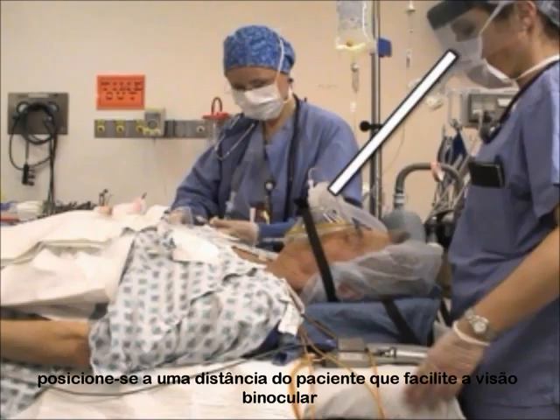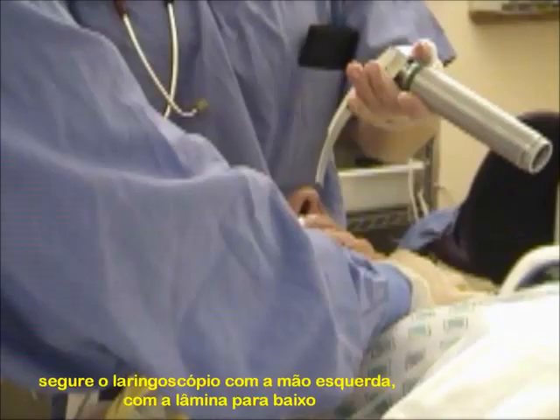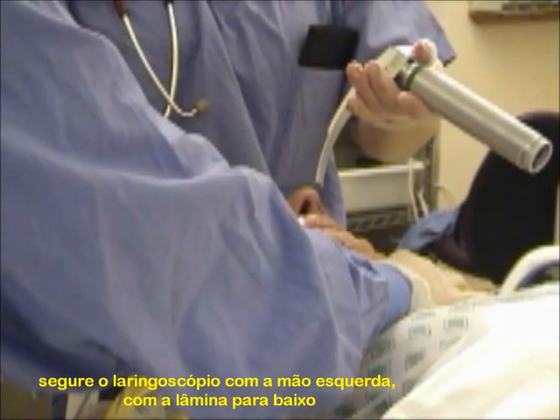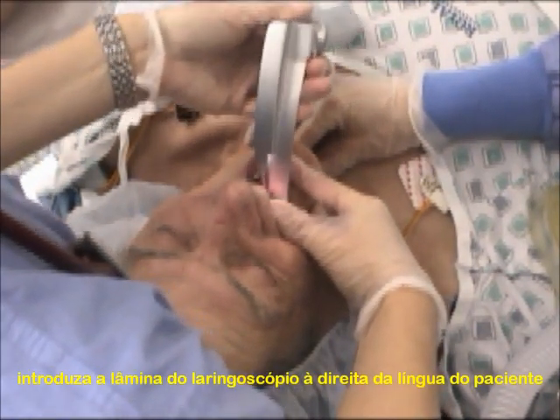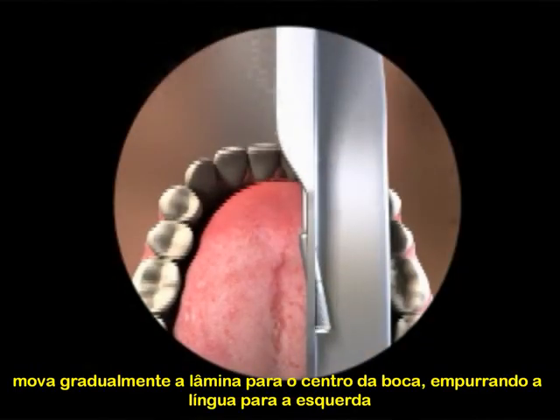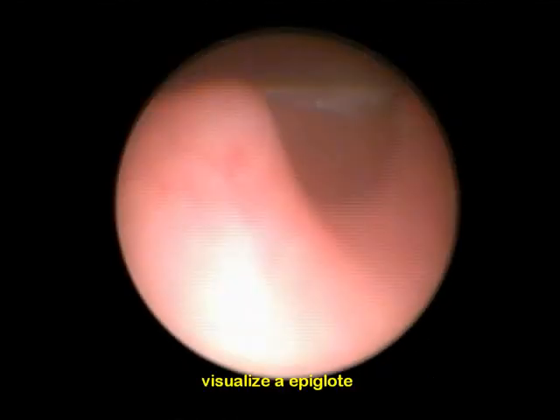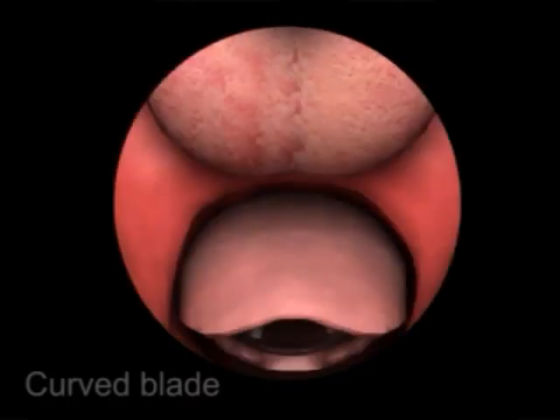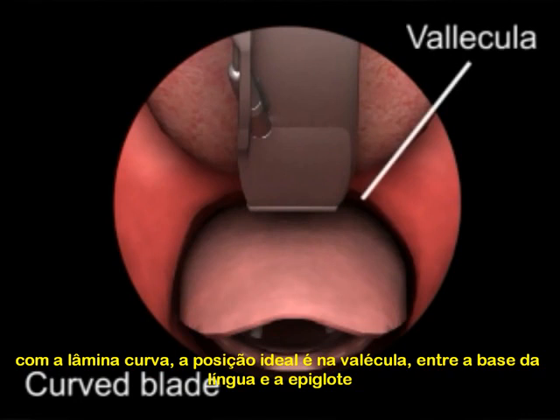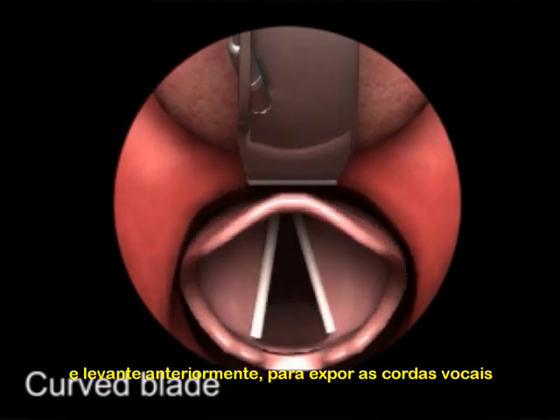Position your body so that your eyes are at a distance from the patient that facilitates binocular vision. Hold the laryngoscope in your left hand, blade down. Open the patient's mouth with your right hand. Insert the laryngoscope blade to the right of the patient's tongue. Gradually move the blade to the center of the mouth, pushing the tongue to the left. Visualize the epiglottis. Place the tip of the curved blade into the vallecula between the base of the tongue and the epiglottis, and lift anteriorly to expose the vocal cords.